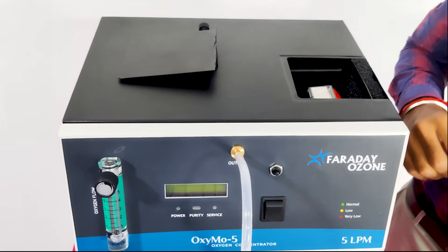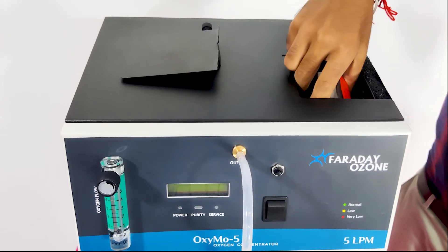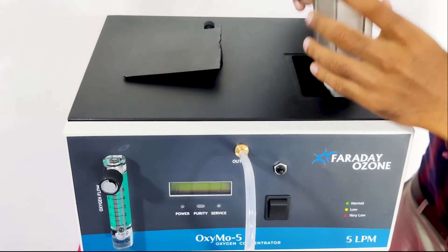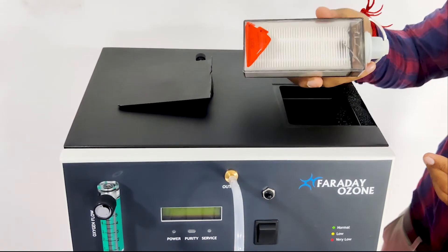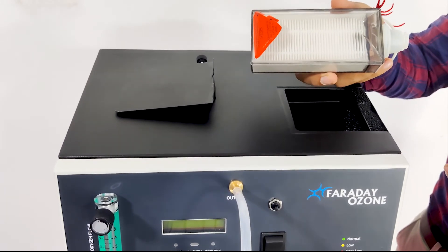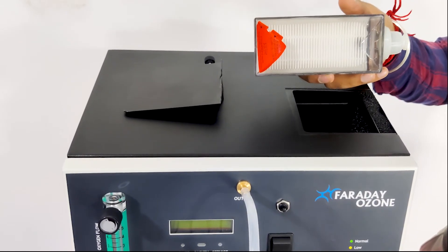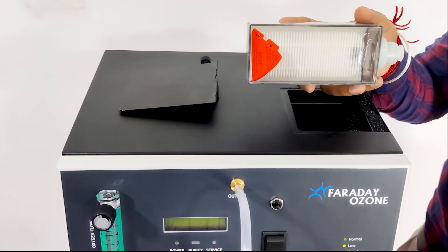The second item is the HEPA filter. The life of the HEPA filter is 2000 hours, and it depends on the atmospheric conditions of the area of usage. Replace the HEPA filter once it exceeds the lifetime — this ensures proper oxygen purity.